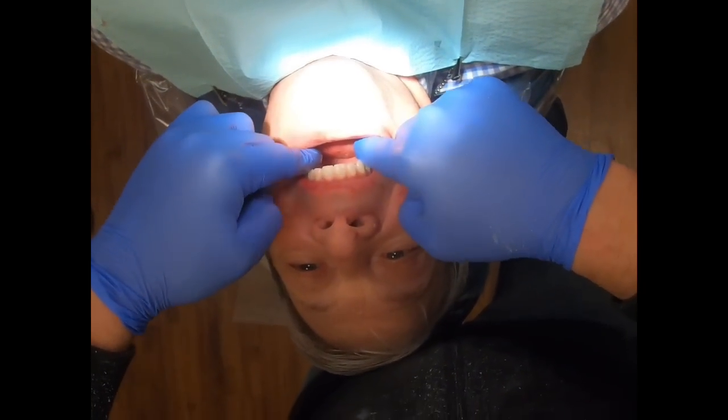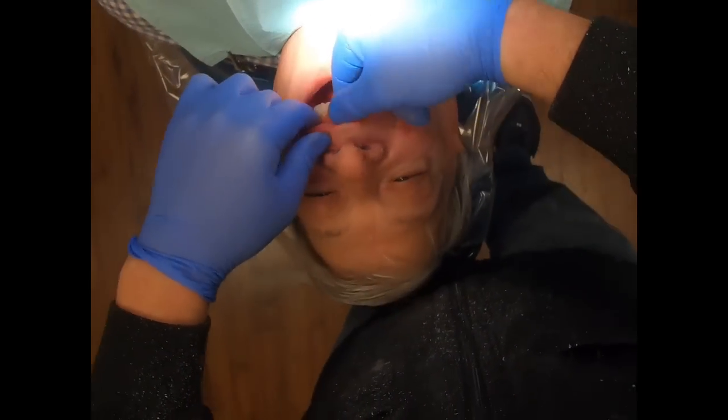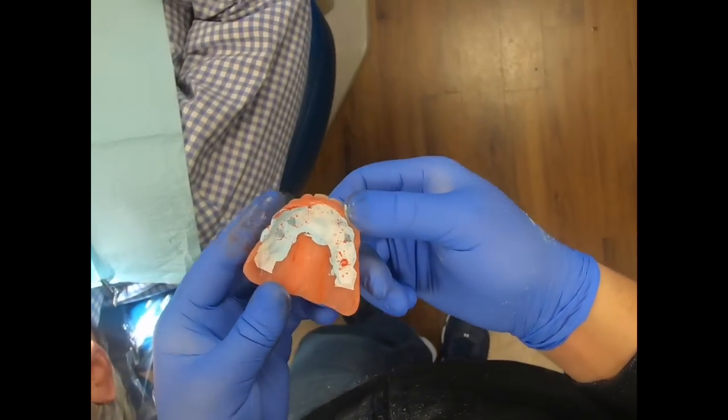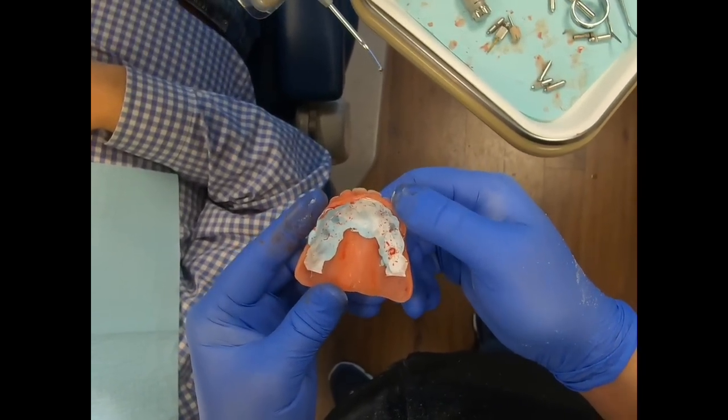So here we just seat it in the mouth, give it some pressure, and now we can remove it even though the material hasn't set up. We can see where there's some burn through, and we need to alleviate that.